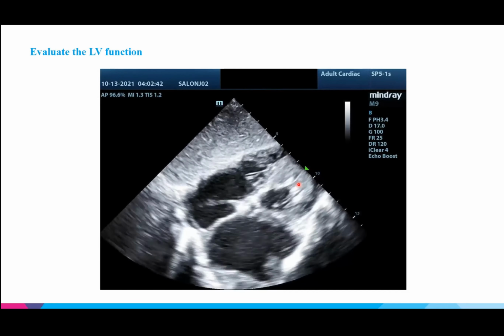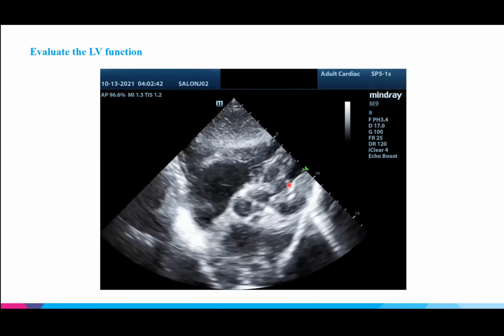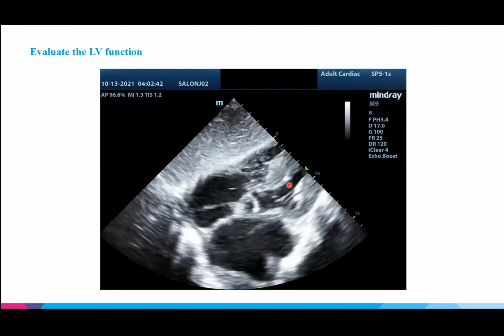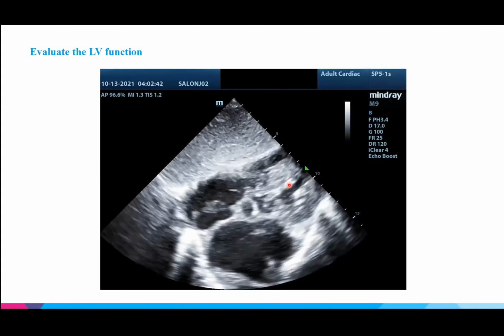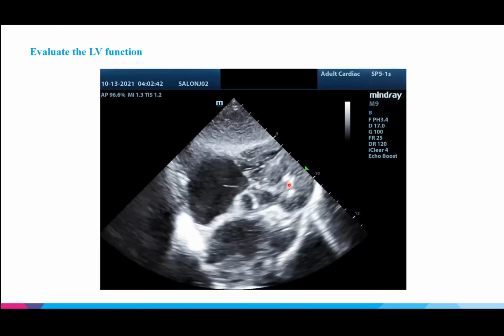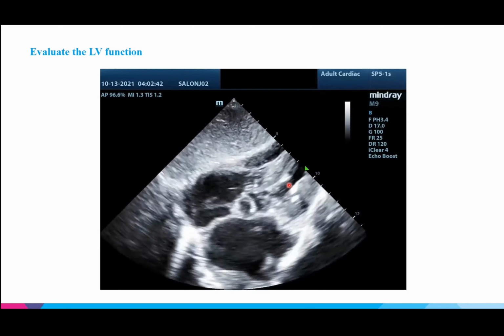So we ran through, I think, 16 clips. Good job, guys. You went through them faster and more efficiently than the residents did when I did it with the residents. Awesome job. We have a few minutes if there's any questions regarding how to get cardiac views or further assess LV function. I'm happy to answer any questions you guys have.